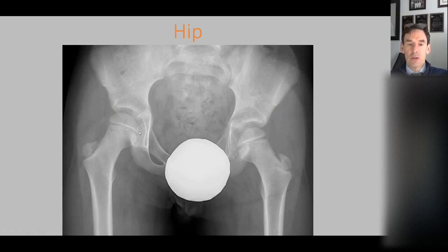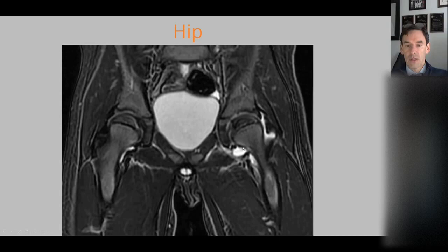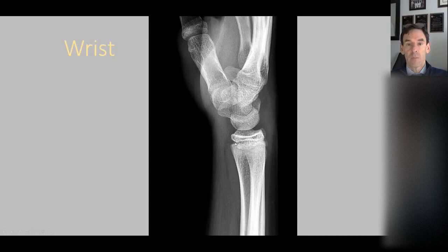In the hip, if we measure the medial joint space between the medial aspect of the femoral head and the acetabulum and compare it to the other side, there's a difference — the left side is a little bit wider than the right side. That is a secondary sign of an effusion. We look for lateral displacement of the femoral head as a sign of effusion, especially in kids. On the MRI, we can see a decent-sized joint effusion, probably from transient synovitis.